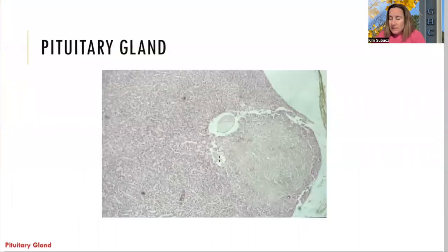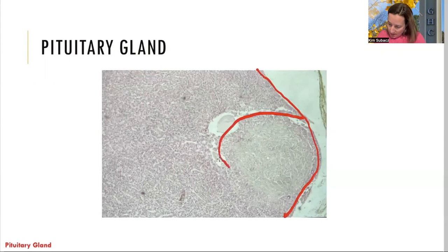So the pituitary gland is going to sit below the brain, below the hypothalamus. It's going to be this little guy, kind of looks like a jelly bean sized little guy that sits down there underneath the hypothalamus. And the pituitary gland is going to have two areas. We got the whole thing in this picture right here, but I hope we can make out that there is a lighter section up here, and then there is this darker section behind.